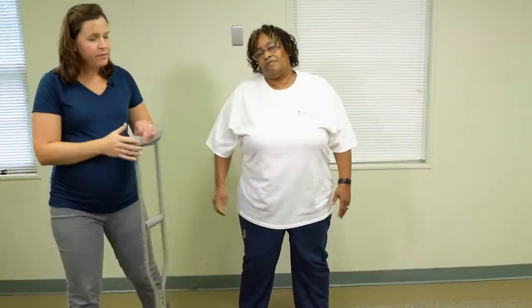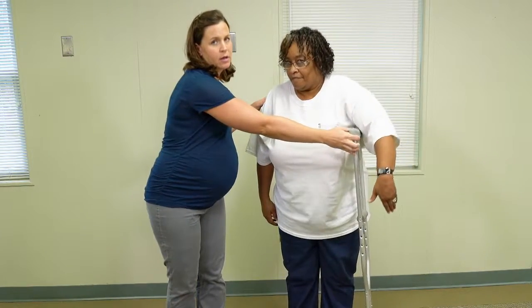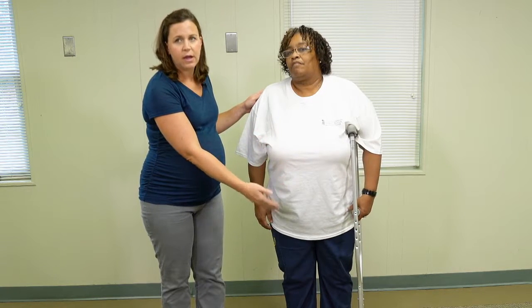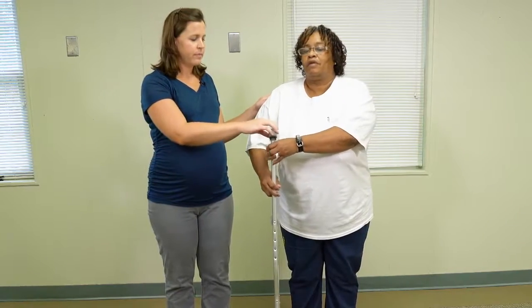Good. So if your affected leg is the right leg, you would put the crutch over on your left side. Same thing if you were to use a cane. If the affected leg is the right leg, you would use the cane over on the left side. If the affected leg is the left side, you're going to keep the cane or the crutch on the right side.